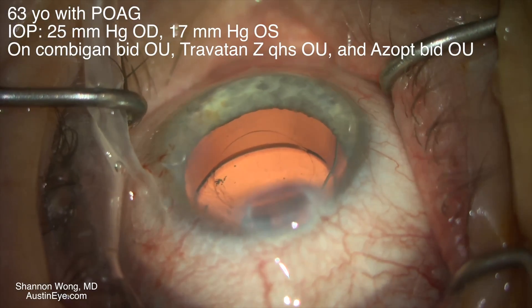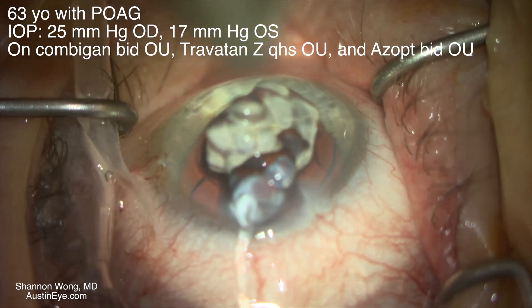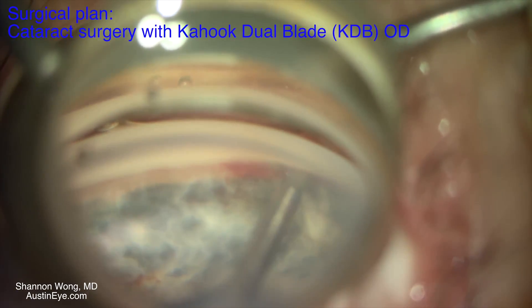These are my first two cases using the Kahook dual blade for treatment of glaucoma. This patient has elevated IOP and is on three different eye drops to control his pressure.